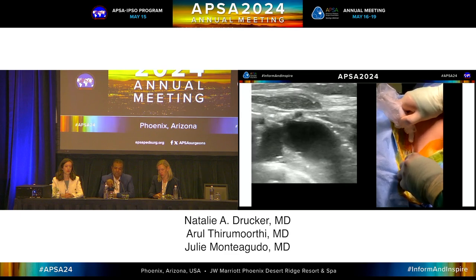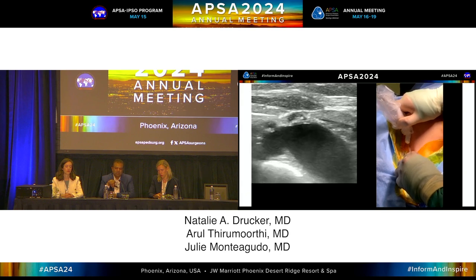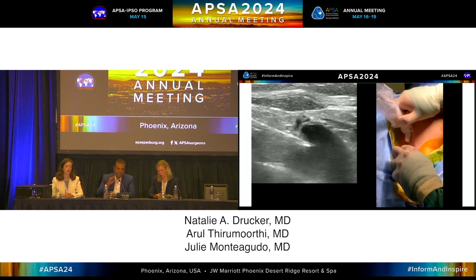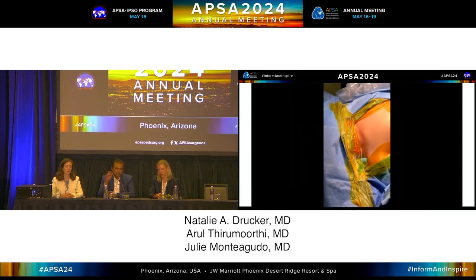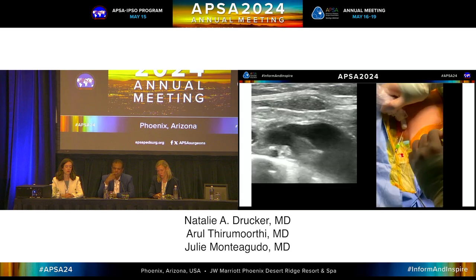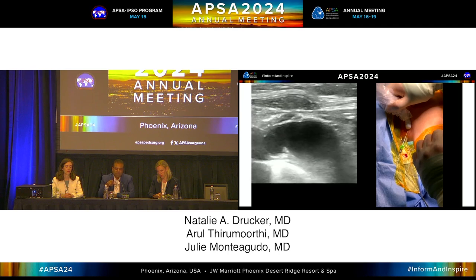You can see how it's a very large confluence. See the needle coming in, coming under the SCM, and then you raise the hub of it so you're angled in, tenting of the endothelium, now you're in. So that's the first part of this. And then right here, just kind of got teed up on this one.